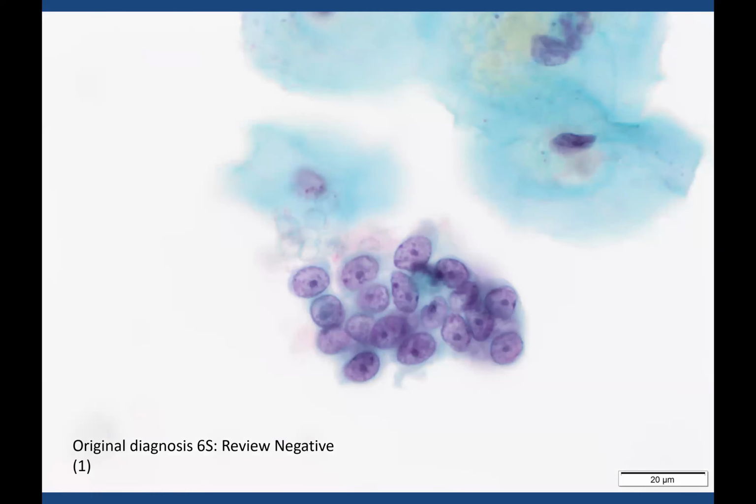Again, this drew the eye because of the nucleoli. Now, endocervical cells are busy cells. They're busy making mucin, so the nucleoli can at times be quite prominent, and that's what you're seeing here. But interestingly, although the nucleoli are prominent, the arrangement of the cells looks pretty uniform. The chromatin looks fine across all of them as well.